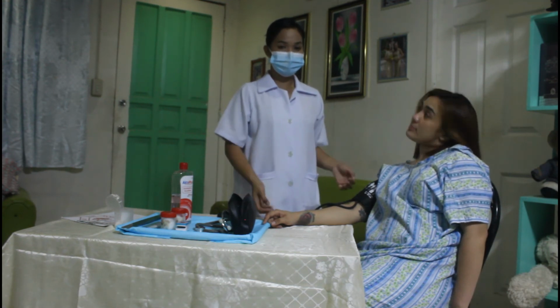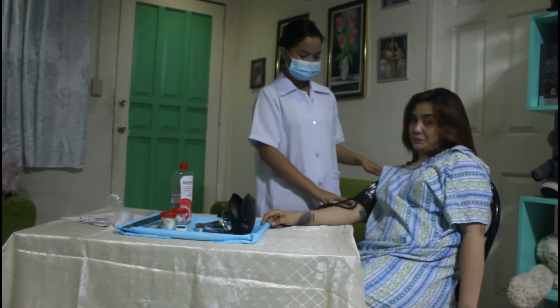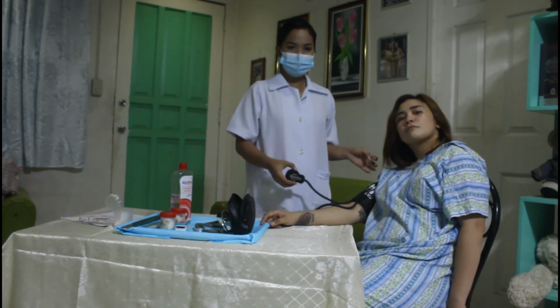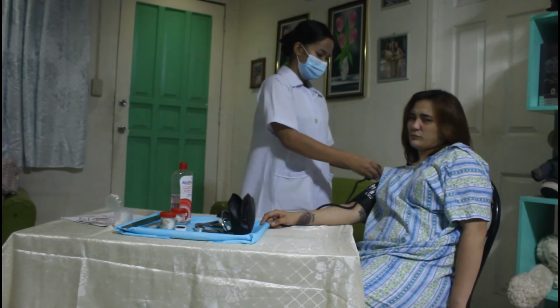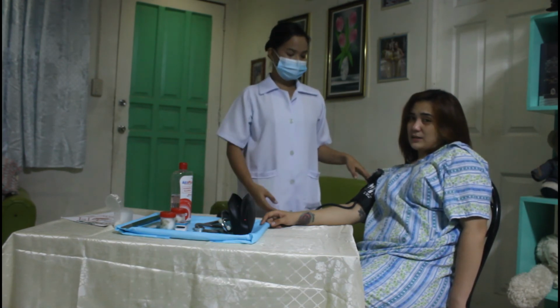And then we palpate the brachial artery. So position cuff 2.5 cm or 1 inch above the site of pulsation. Then we place or position the manometer gauge vertically at eye level and no further than 1 meter away. So looking up or down at the scale results in inaccurate readings.